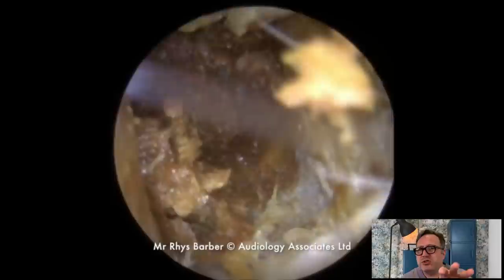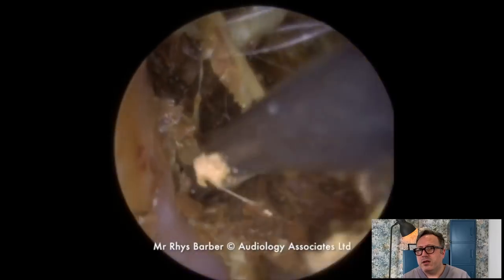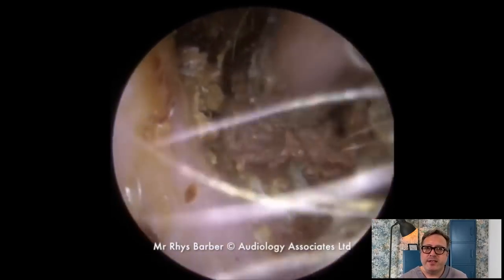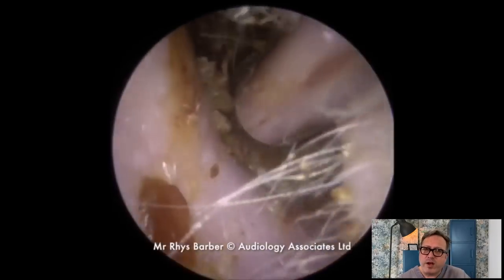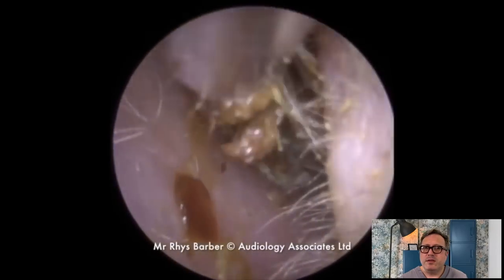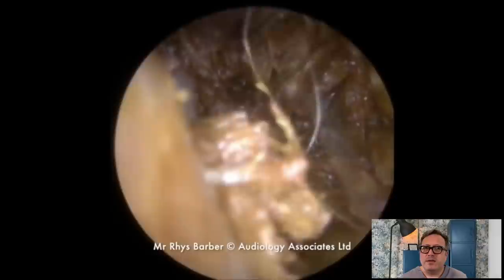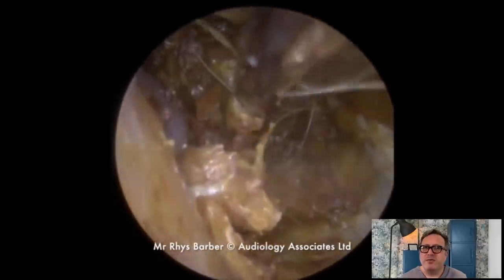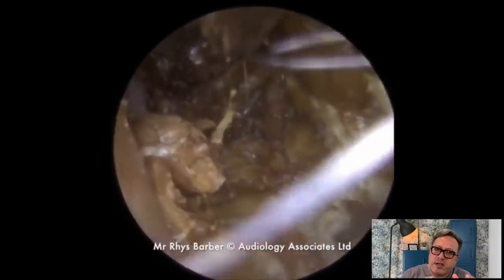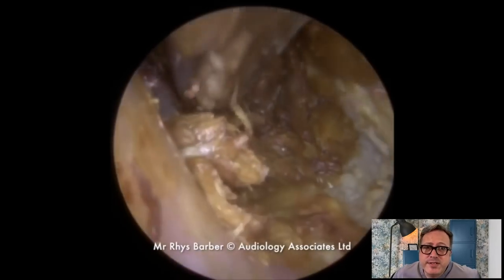That section we're just touching on there with the jobson horn looks a little bit harder — see how it looks a different texture? I'm just pulling this down now, so far more crumbly, drier type material in there. Just doing a bit of tidying up with the standard size Zolna tube, hoovering up all the looser bits. It gives me a better idea of what we're working on next. If you look at the canal walls, you can see they look a little bit pink, with a little bit of white dead skin material.